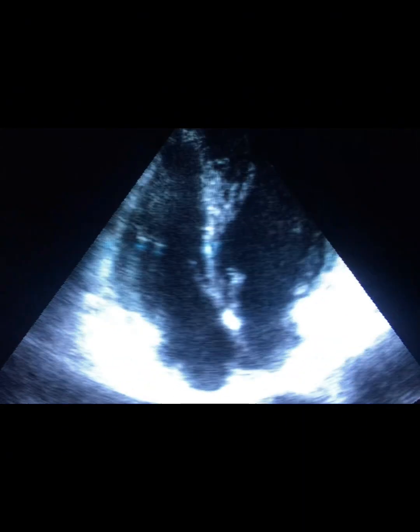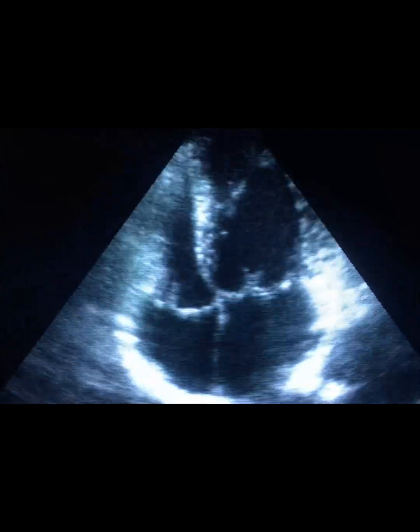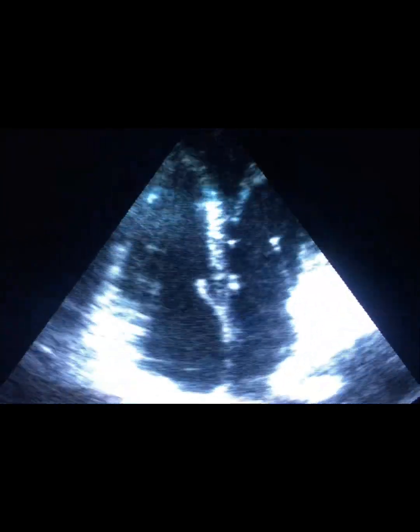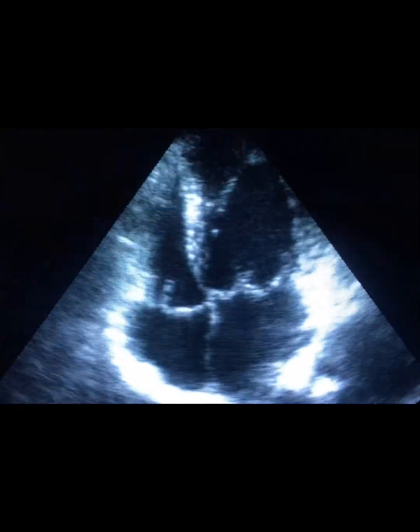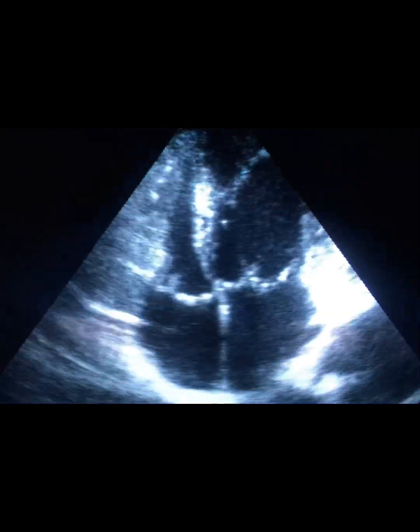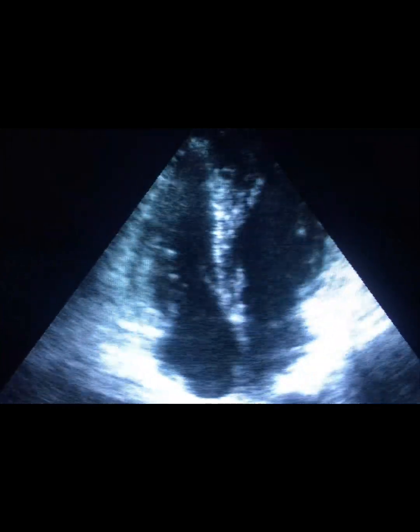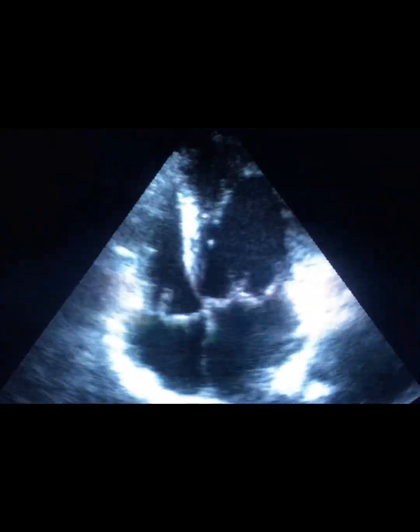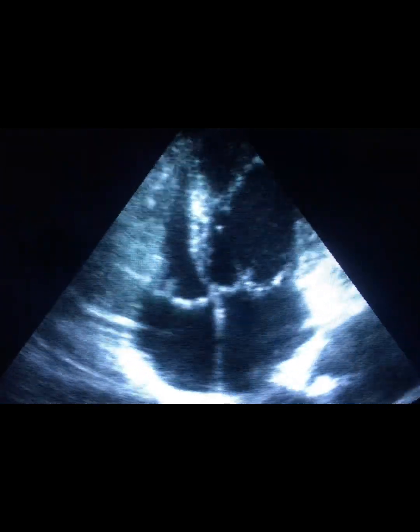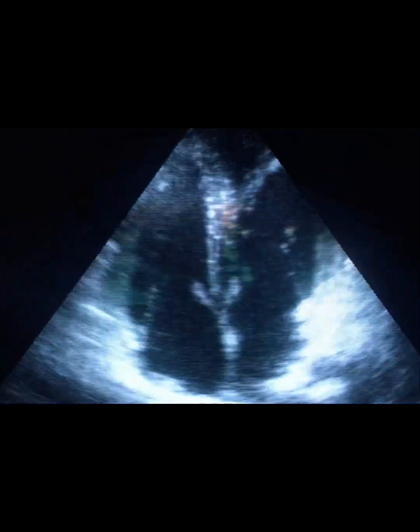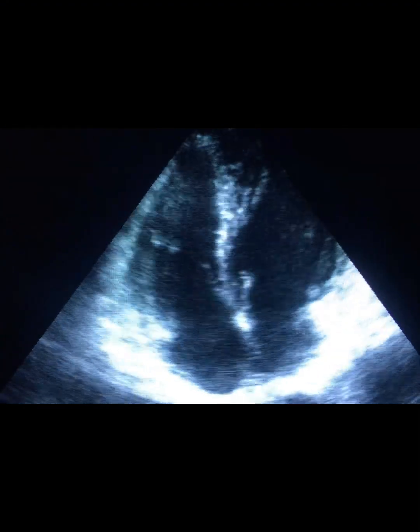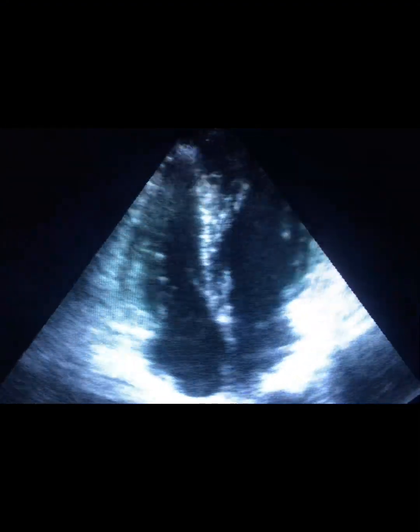To sum up: the RV is the systemic ventricle, is on the left side, and is connected to the aorta. This is a congenitally corrected transposition of the great vessels, or LTGA.